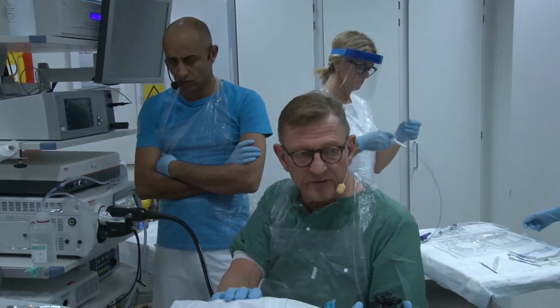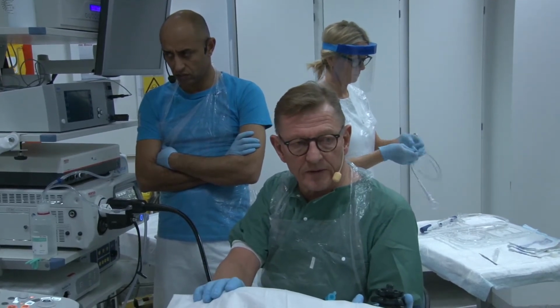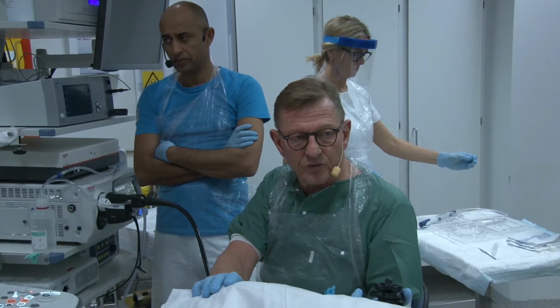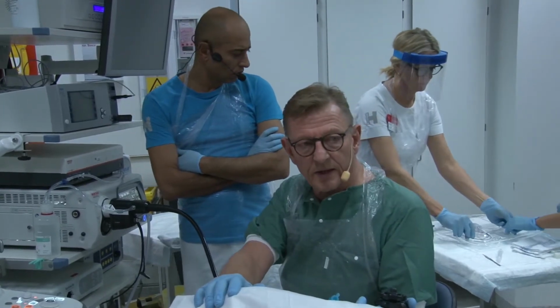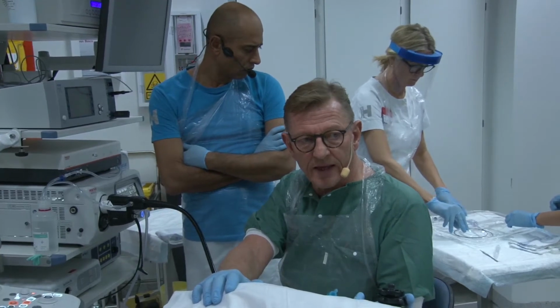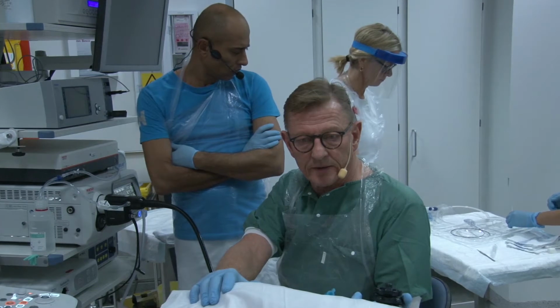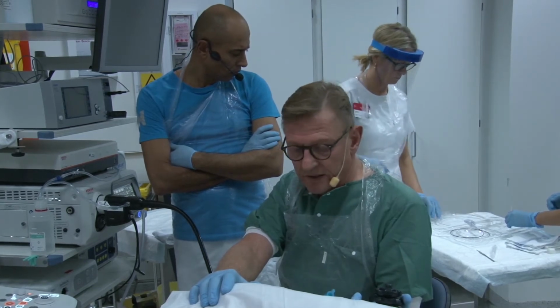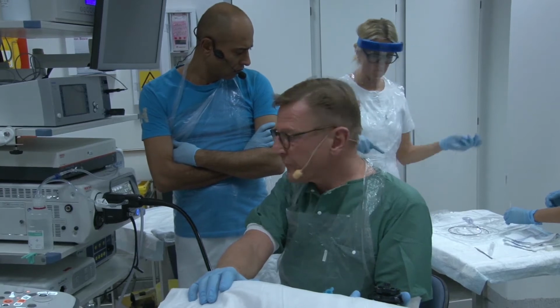It's a 19-gauge needle. Personally, we use the Flex needle from Boston, which is a nitinol needle, but I think you can also use other 19-gauge needles for this.